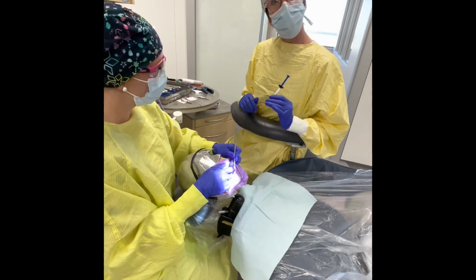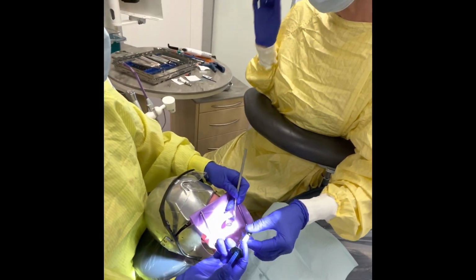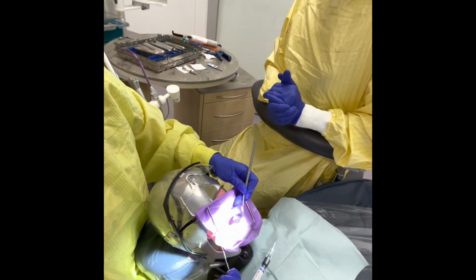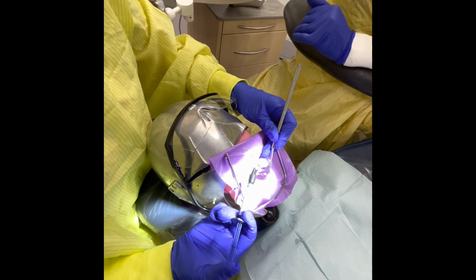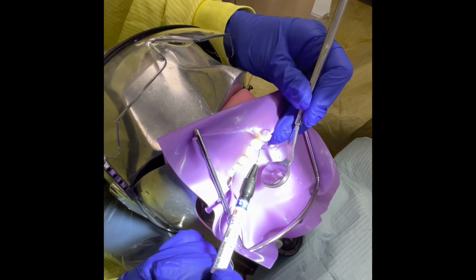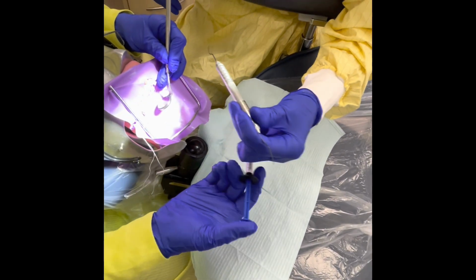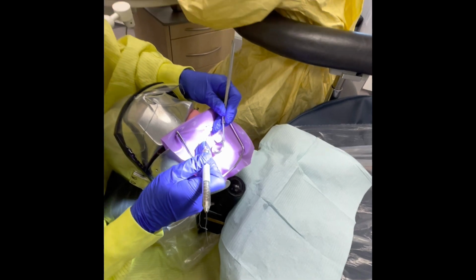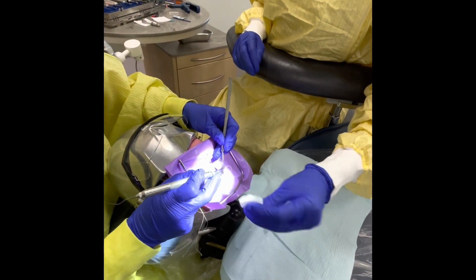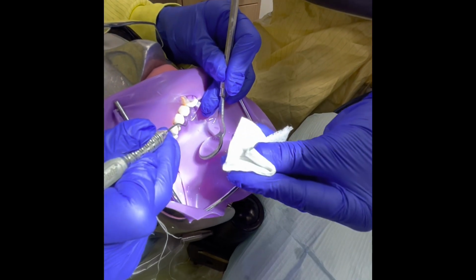All right, so the first material I'm going to pass Amanda is the flowable composite. Okay, so a lot of operators will use a flowable composite as a liner essentially on their anterior teeth or on their composites. So your operator will place the flowable into the preparation. You'll pass it back, and you'll then use an explorer to move the flowable around, having a gauze ready to wipe that off of the instrument as needed.